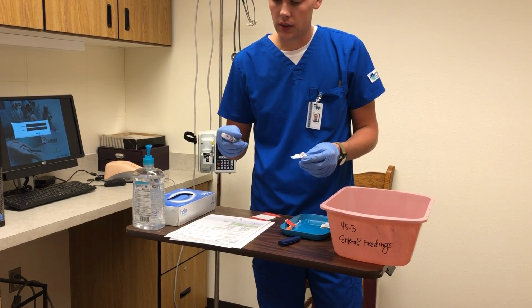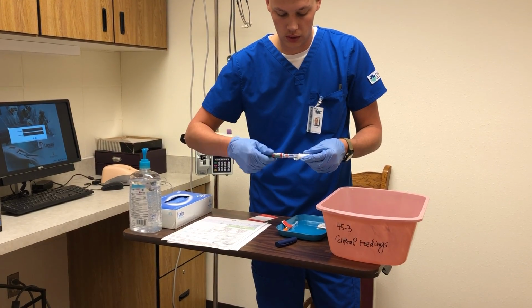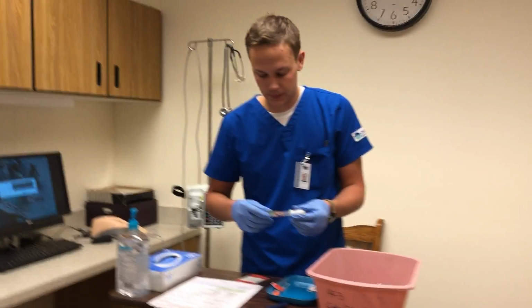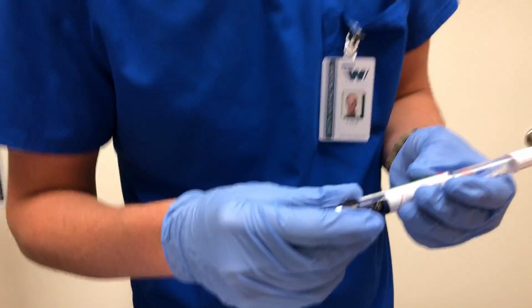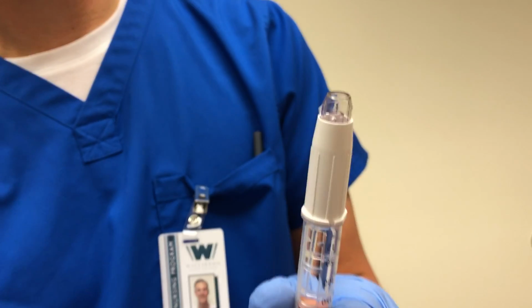And so since that is sterilized, I can just put this right on and then screw it on. Okay. Take that out. And so then I will have to prime it to 2. So it's going to go 1 click, 2 click. So we're at 2. And then we're just going to push to make sure something comes out.